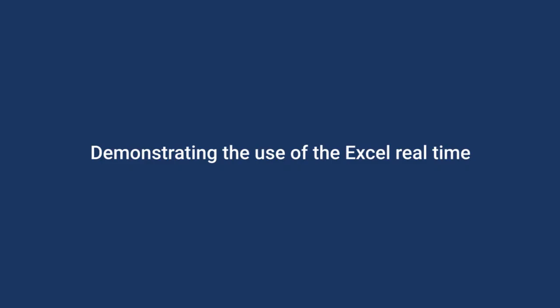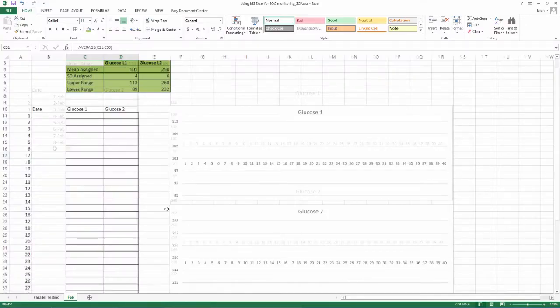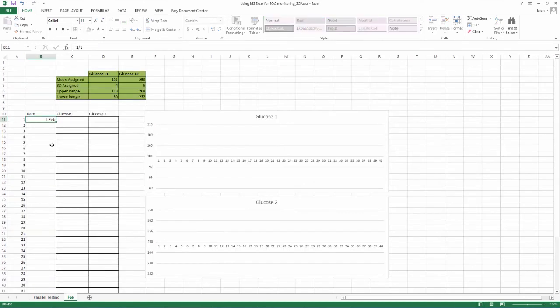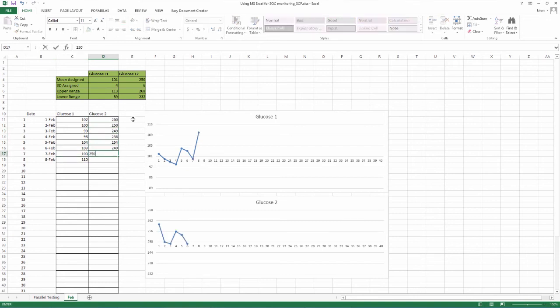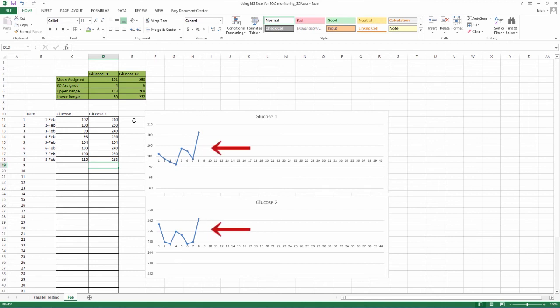Demonstrating the use of the excel real time. Now, let us input some values and see the developing graph mean and SD. 8 values have been put in from Feb 1 to Feb 8 for both L1 and L2 and as the values are input, the graph develops. What do you see on 8th Feb? A 22s violation. As the graphs are seen simultaneously, this becomes readily evident.